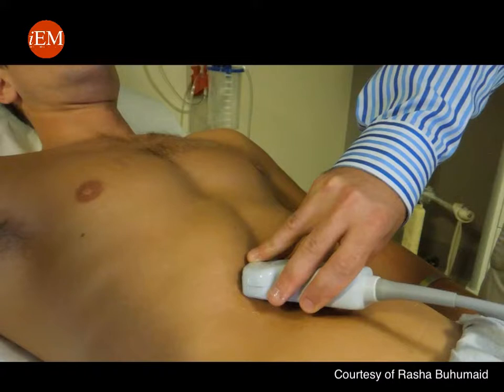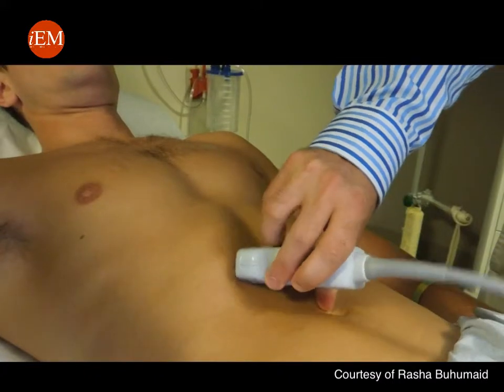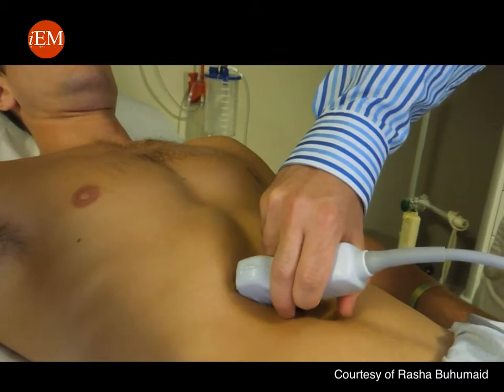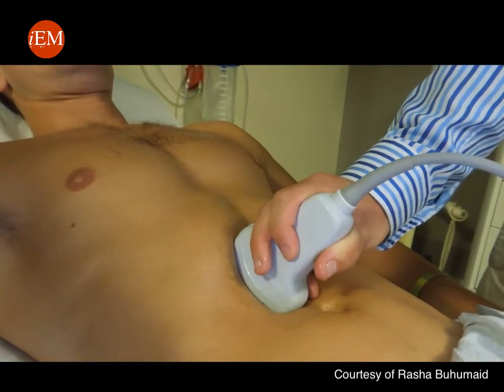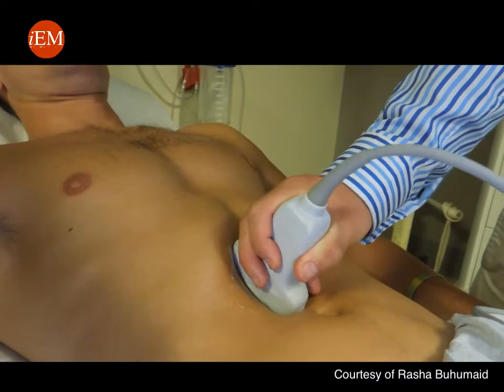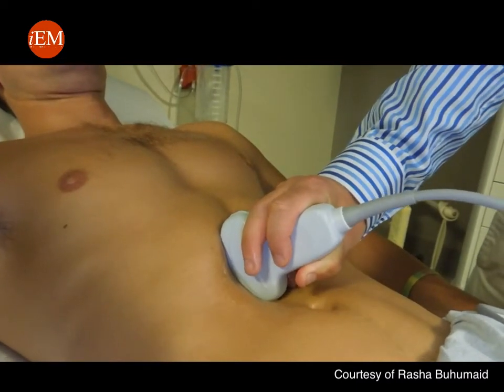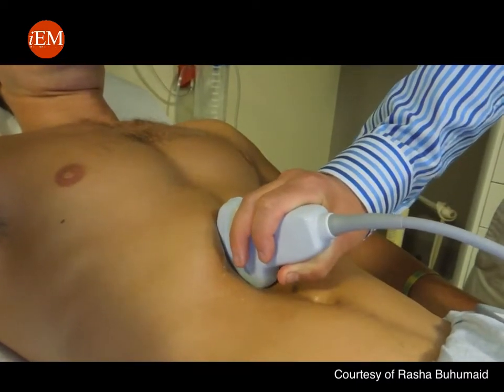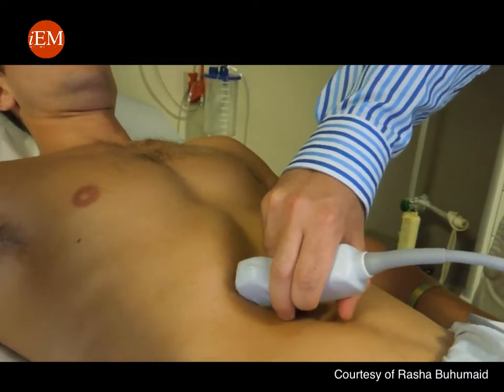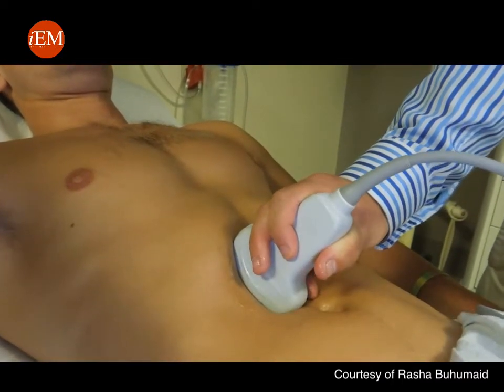Once you obtain a sub-xiphoid view of the heart, you will rotate the probe to get a longitudinal view and the probe marker will be towards the patient's head. You will then rock the probe and slide it slightly to the right to be able to visualize the IVC draining into the right atrium.